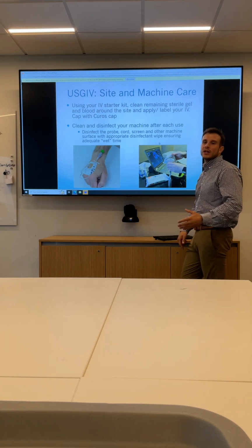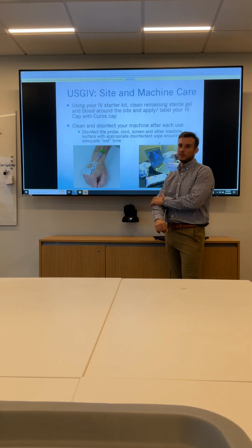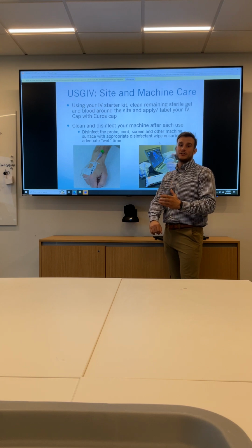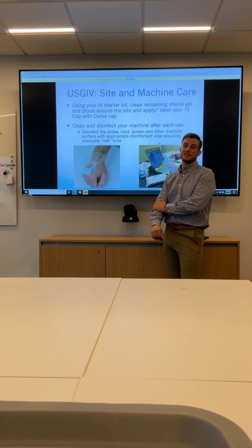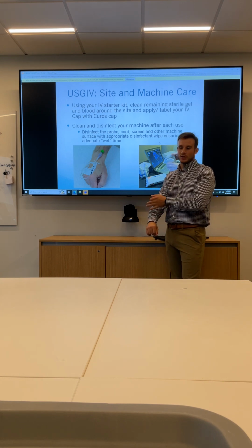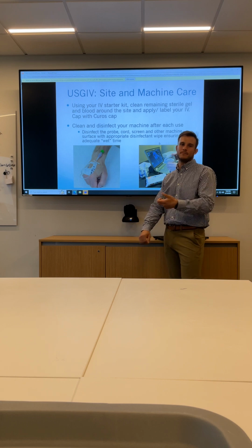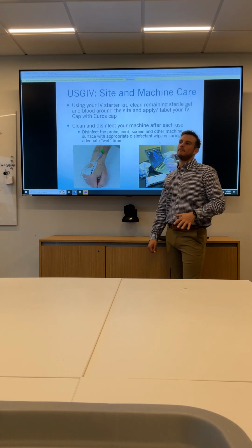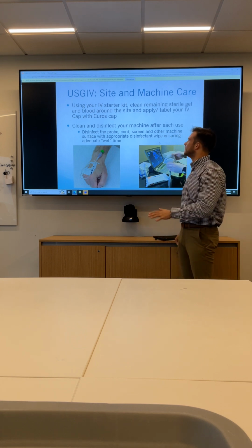So the ultrasound jelly can get a little bit sticky. Some facilities offer skin prep, which will help. You want to be sure that it's completely dry and that you've gotten all that jelly off, because if you wipe and you go to stick that dressing on there, sometimes it'll peel away. Another thing to keep in mind, if a patient has excess arm hair, it might behoove you to prep and shave the area first. You can look for the vein, come back, and then restart the sterilization process. It's okay to break sterility and then re-sterilize, especially if there's extra hair on that arm. The dressing's not going to stick as well, and it'll hurt when you're pulling it off. So just be mindful of that.